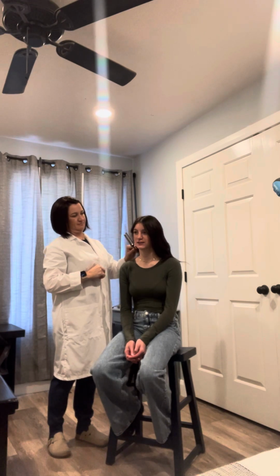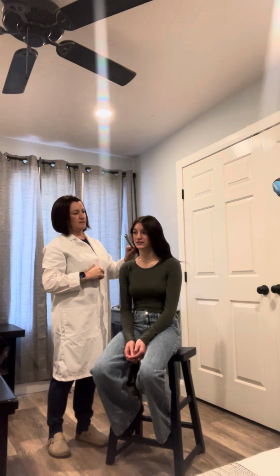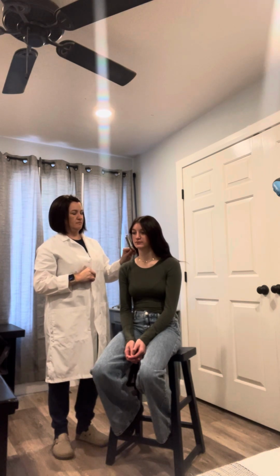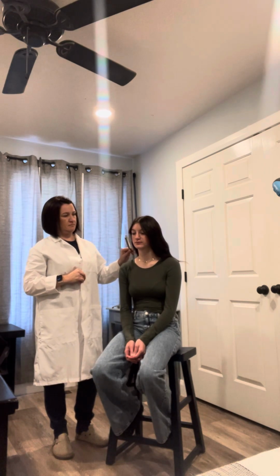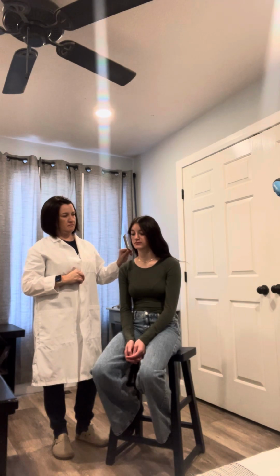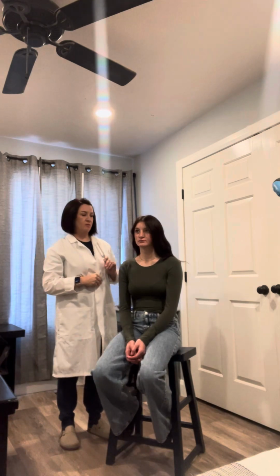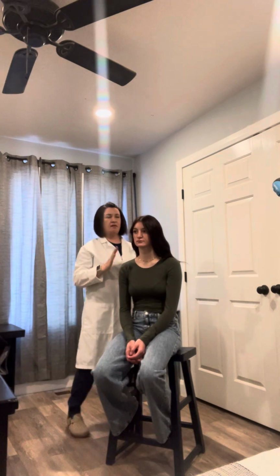I can't hear it. Can you hear it still? Yeah. Okay, tell me when you can't hear it anymore. I can't hear it anymore. Okay, so air conduction is greater than bone conduction, so that's good, and I would repeat that on both sides.